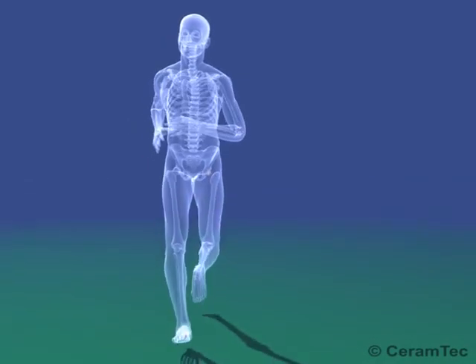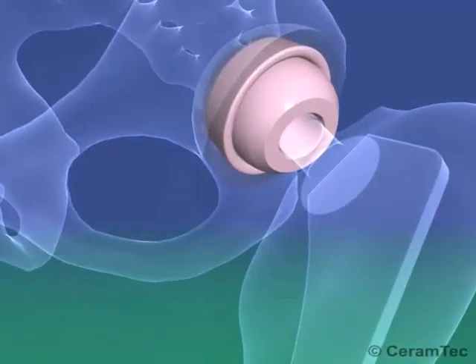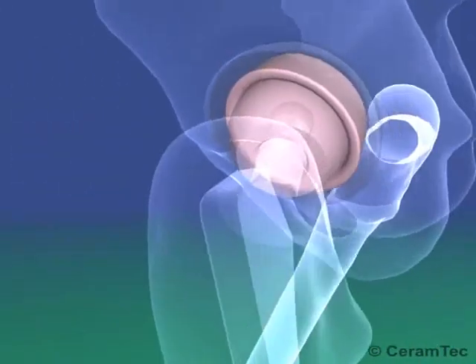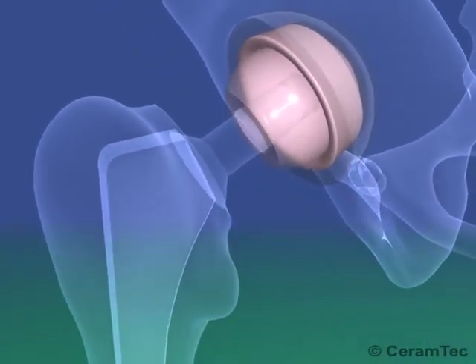Ceramic inserts were introduced primarily because of their low wear rate when used in combination with ceramic ball heads. The problems associated with polyethylene wear particles as well as with metal ions can thus be avoided.